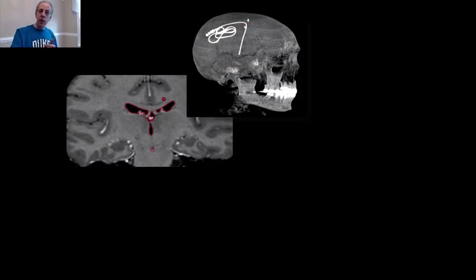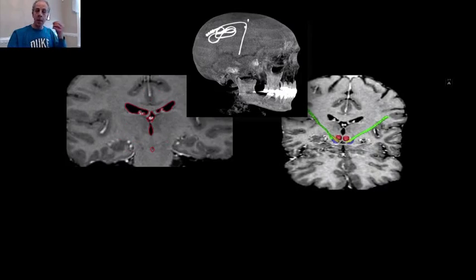We have segmentations of the regions, and then the neurosurgeon can, after surgery, see, was I in the right place? As I say, the subject is awake and giving feedback to the neurosurgeon. For example, if it's a surgery for Parkinson's, you can experiment with different behaviors to see if they improve with the position of the electrode.